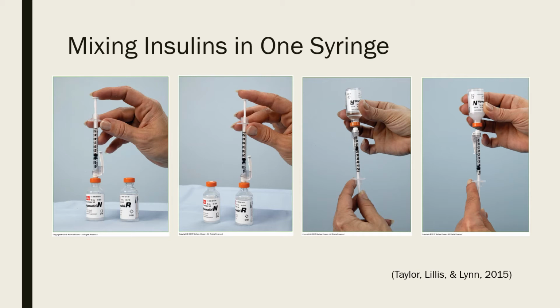So I do want to tell you, putting the air in creates a negative vacuum, so that helps to withdraw the medication easier. So sometimes you'll go in, you have a multi-dose vial, and you stick the air in, and it immediately comes back. And that means people have put air into that vial without withdrawing the proper amount, so the air stays in there, so then you've got too much air. So always make sure you only put in what you're going to take out, and that you take that amount back out.